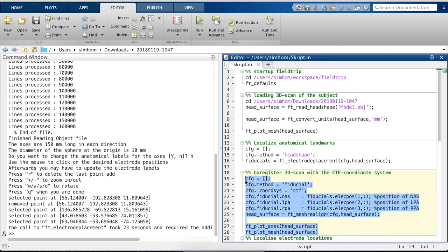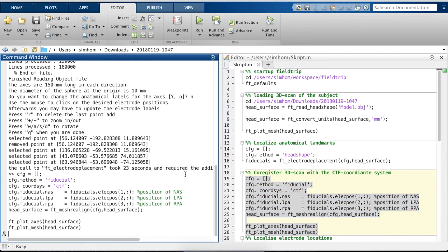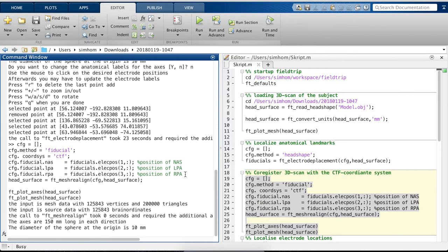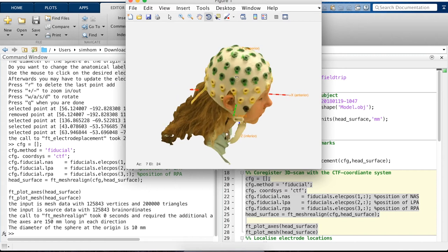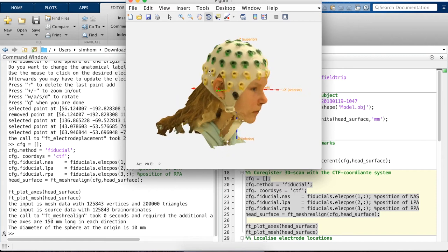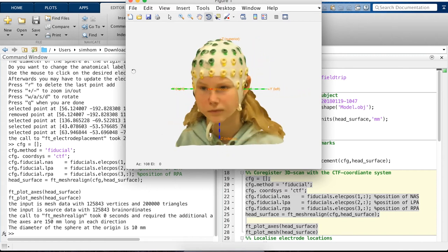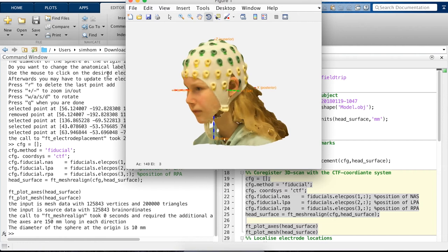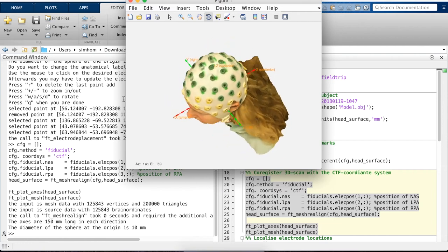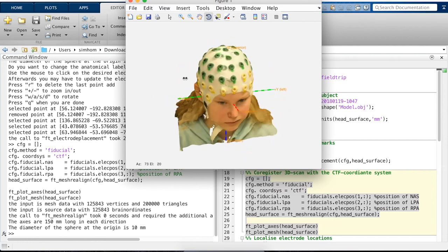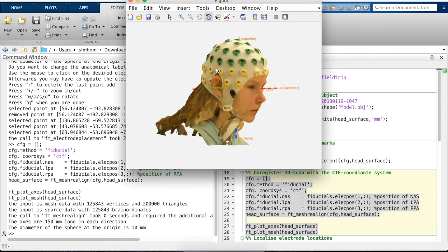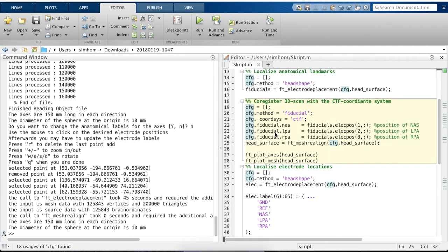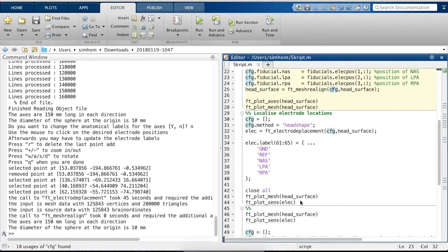The next step, we register the 3D scan into the CTF coordinate system. Again, we can nicely see how the axis goes directly to the fiducials where we clicked them. The marking thing is that we can see the x-axis, the back part, goes below the cap, which is not what we expected.